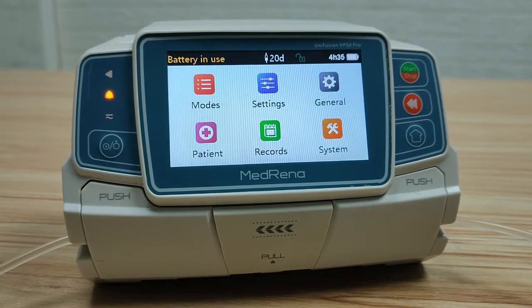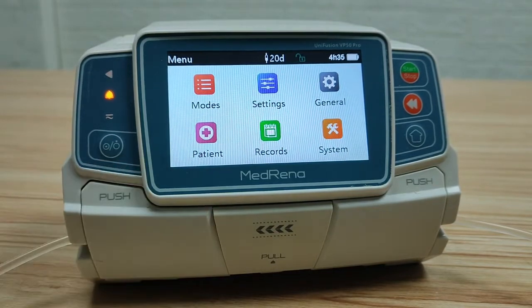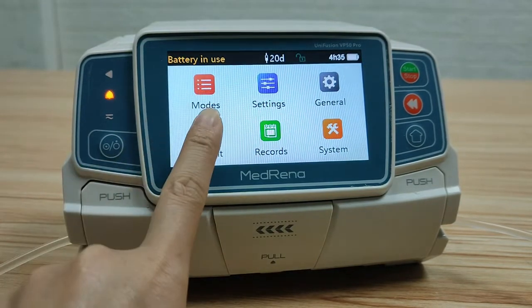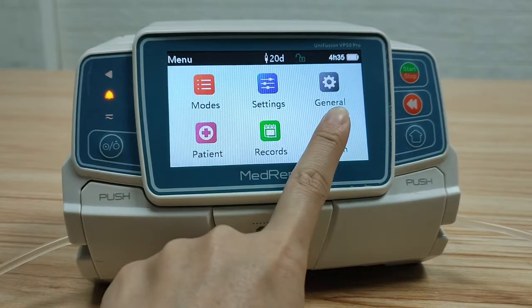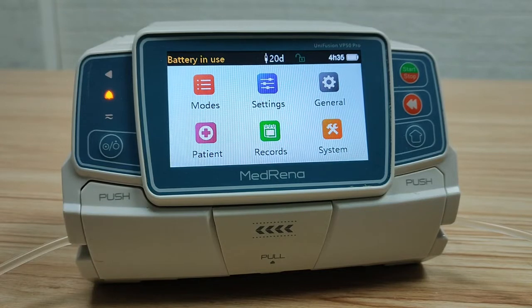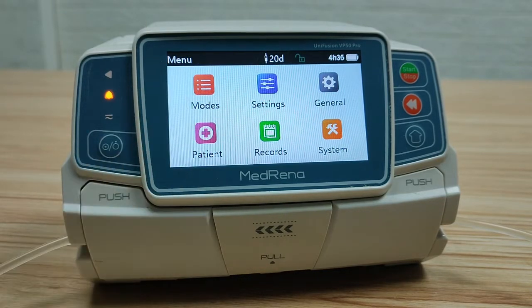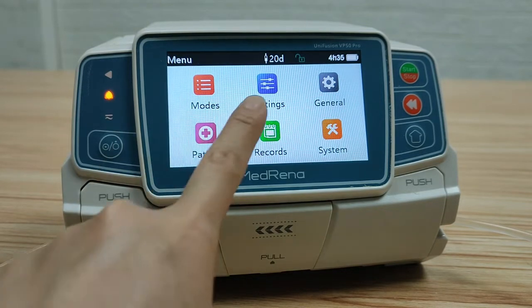This video introduces the settings of the MedRena infusion pump, model name Unifusion VP50 Pro. This is the home page. There are six boxes on the screen: Modes, Settings, general, patient, records, and system. In the last video we introduced Modes; next let's look at the other boxes one by one, starting with settings.